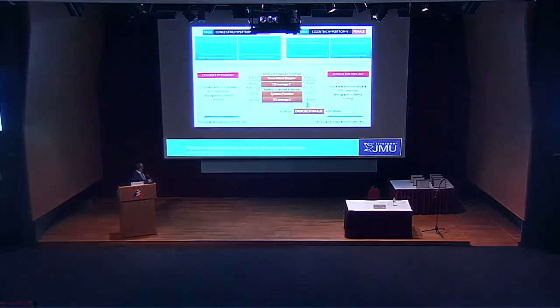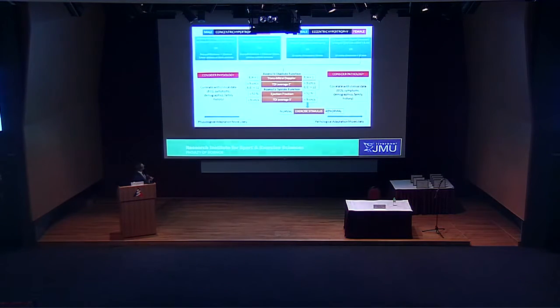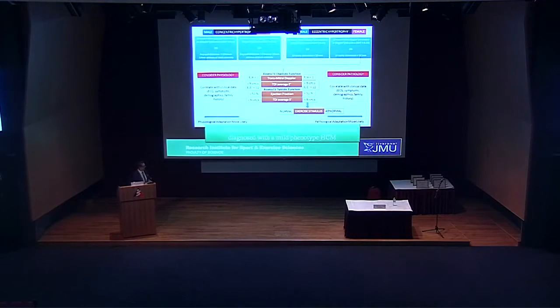So we go down the algorithm. He's got concentric hypertrophy. His EA ratio is less than 1. His average E prime, well, I just showed his septum, was certainly less than 9. This was normal, but we had to consider pathology. He's also got an abnormal ECG. He's also got some family history. He went on to have MRI, and there was patchy fibrosis, and he had a mild phenotype HCM.